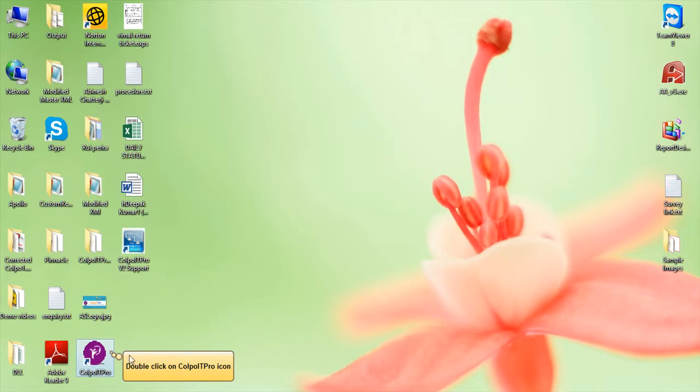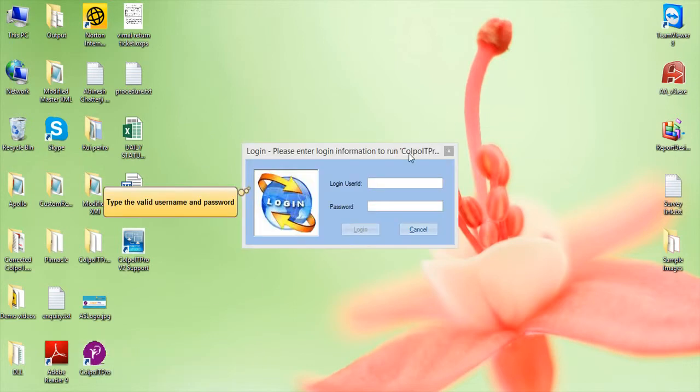Double click on the Colpo IT Pro icon on your desktop. Type the valid user ID and password.